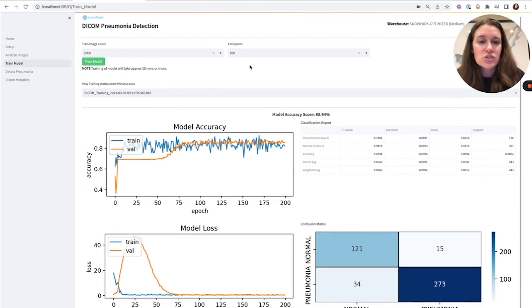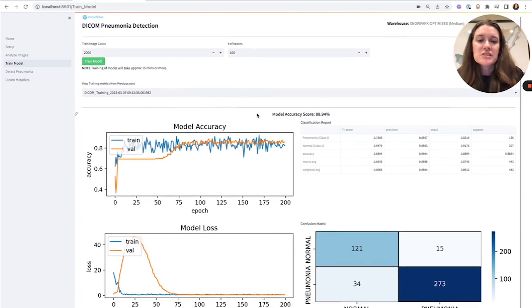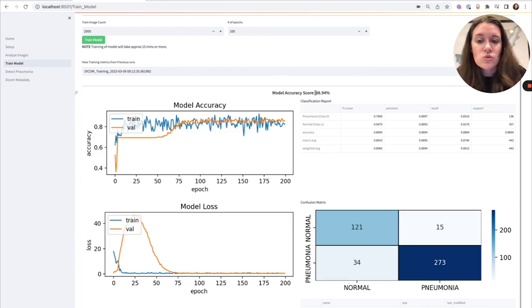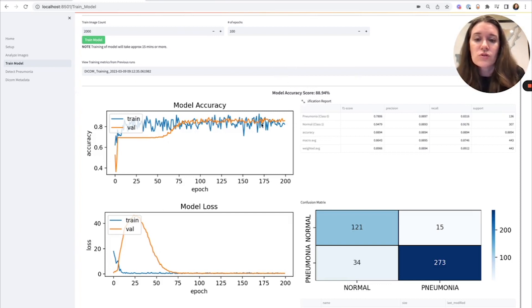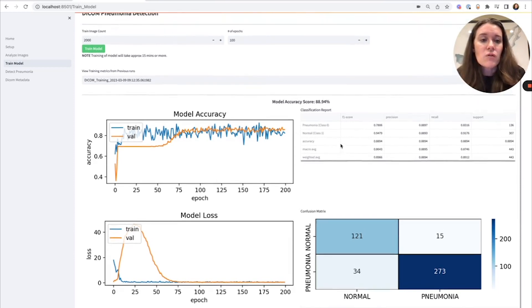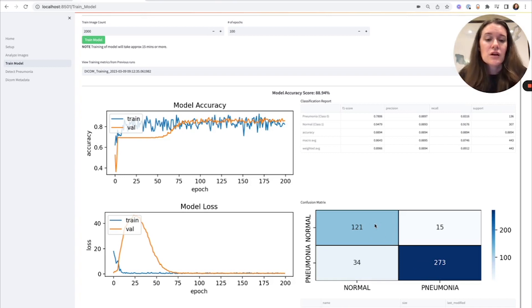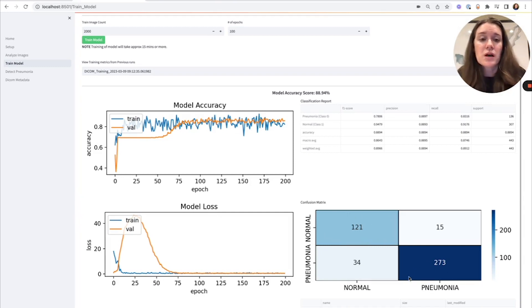I'm going to show you a model I trained a little bit earlier today. You can see a report I've created where I can look at my overall accuracy score, how my loss is converging over those epochs, and my different class metrics — F1 score, precision, and recall. I've also got my confusion matrix. Overall my model is doing quite well, differentiating between a normal x-ray and a pneumonia x-ray with very few false positives and false negatives.